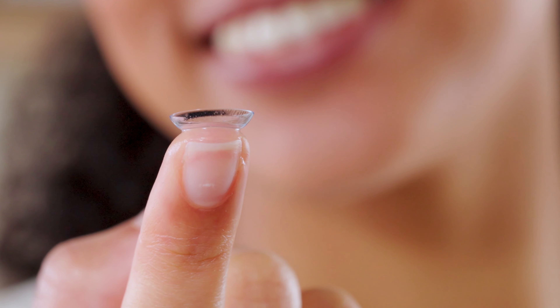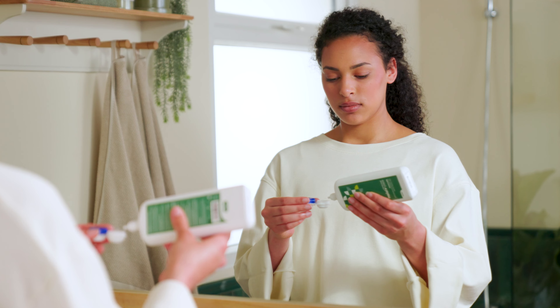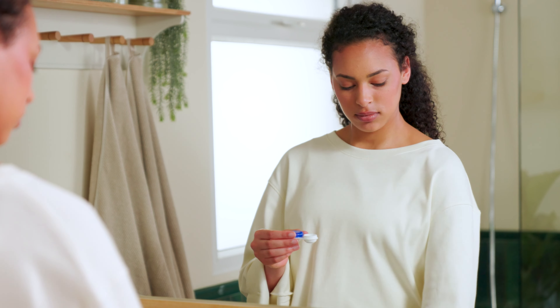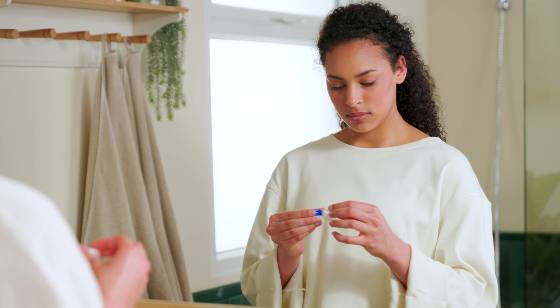Before you put in your lens, check it's the right way round. If it has a lip, it means it's inside out. It should be a bowl shape if that helps. It's also a good idea to check for any tears or dirt. If you have monthlies and they need a clean, use some fresh solution. But if your lens is damaged, throw it away and start again with a new lens.